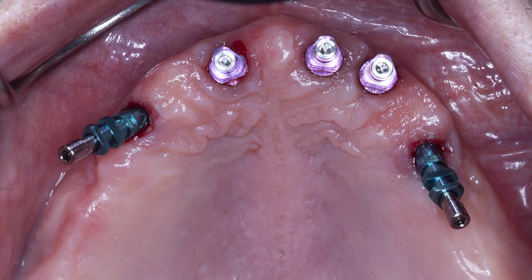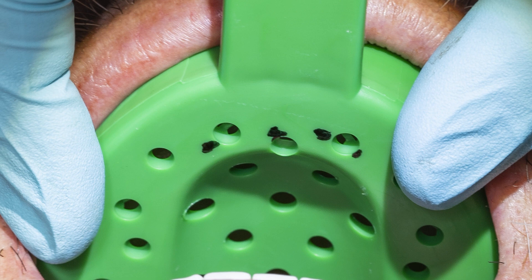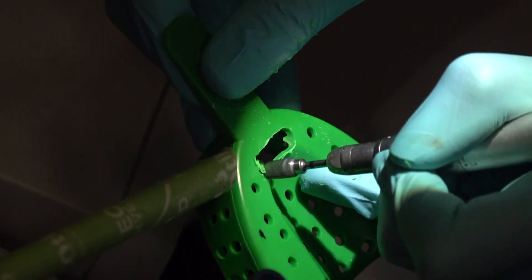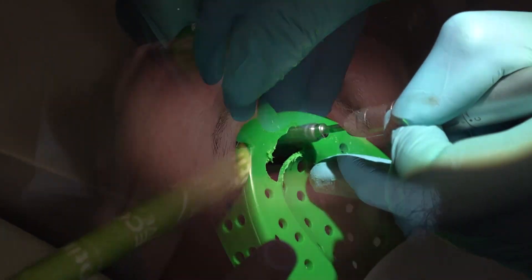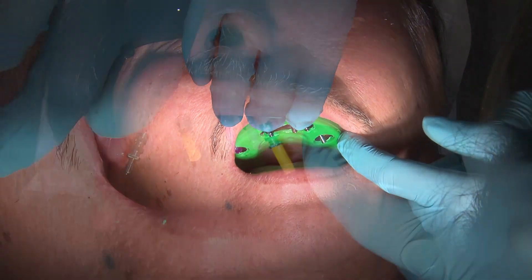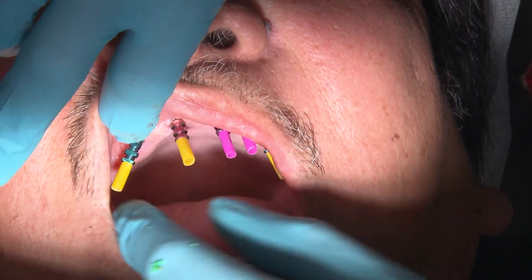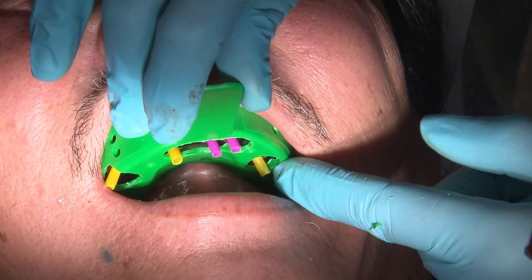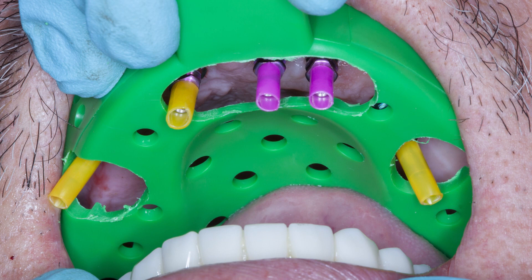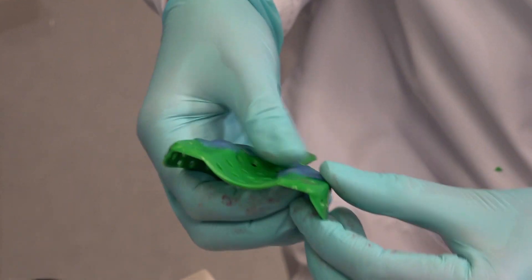Once all the copings are confirmed, I then make adjustments to the stock tray. I like to mark the tray directly in the mouth to identify the location of the copings. Utilizing a coarse-cut carbide burr, I then perforate holes into the tray accordingly. There are trays on the market that have pop-out sections for your convenience if you do not want to go through the trouble of cutting holes in one of your stock trays. Here you can see that the plastic block-out sleeves were each cut to the appropriate size and placed over the guide pins. I always try the tray in at this point to verify that the transfer copings are correctly aligned with the holes in the tray. I make sure that I know my path of insertion, which I have marked here with a black line. The last thing you want is for one of your transfer copings to not pop through the tray and get lost in the impression material.